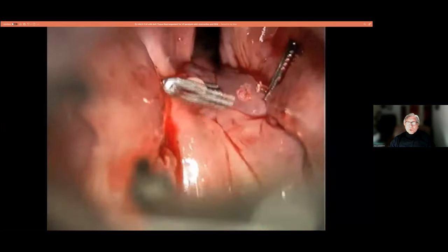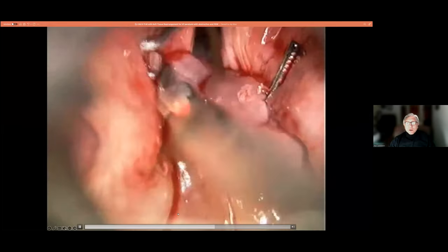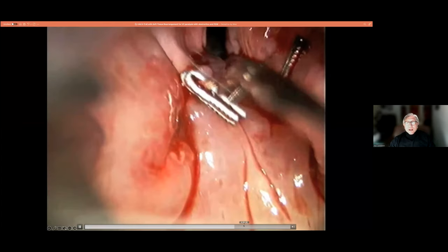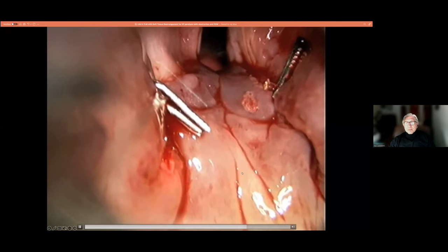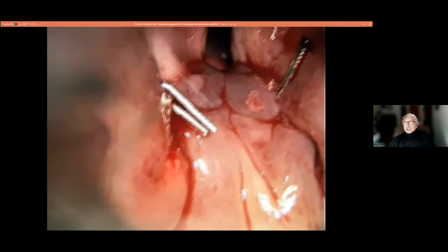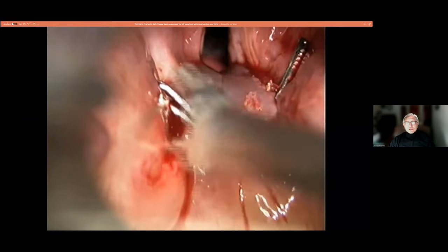I've been asked more times than I can count, what happens to these clips when they fall off. Of course, I made that point earlier that it matters not. If they fall off, it's not an issue. You can have two clips on a suture. It doesn't matter. Patient will cough them out, and eventually they will end up in the Ganges River or somewhere else for the GI tract.